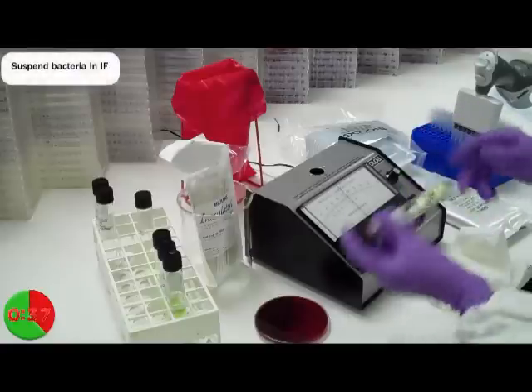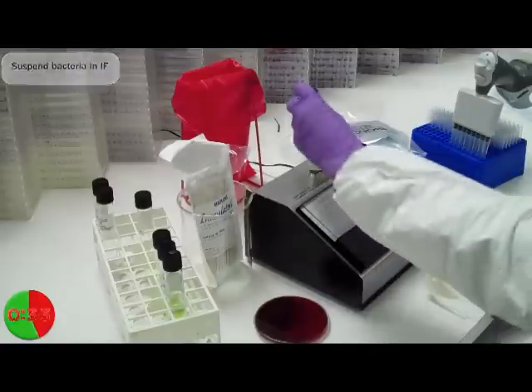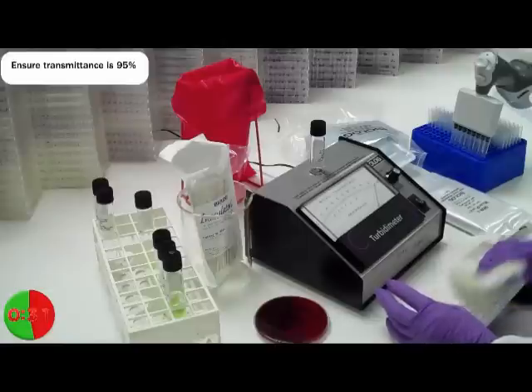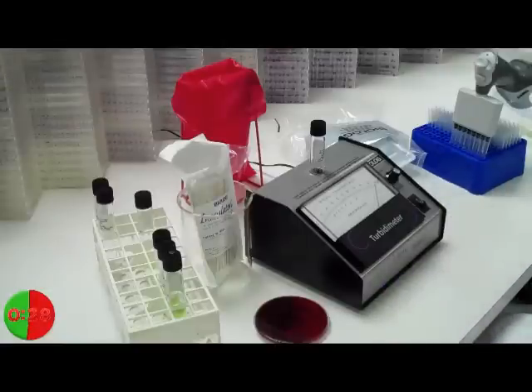Suspend the cells in the inoculating fluid and check the turbidity for the desired transmittance of 95%. Again, place the tube in the meter with the label facing forward.